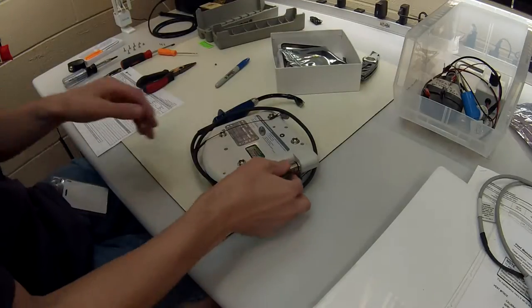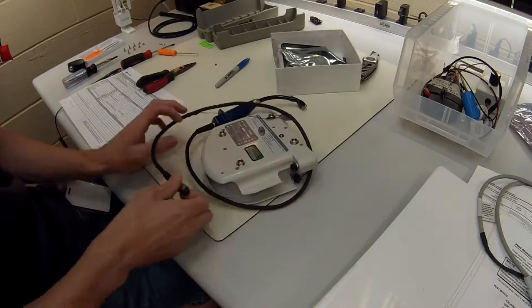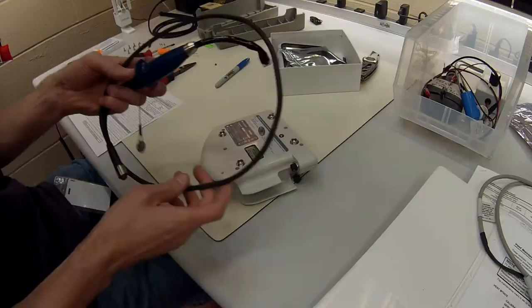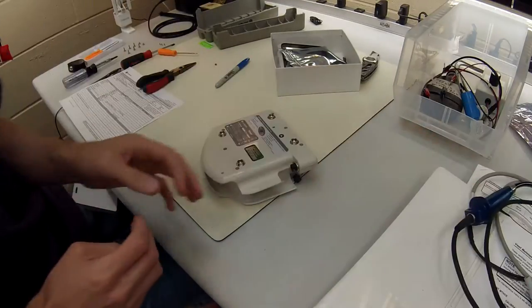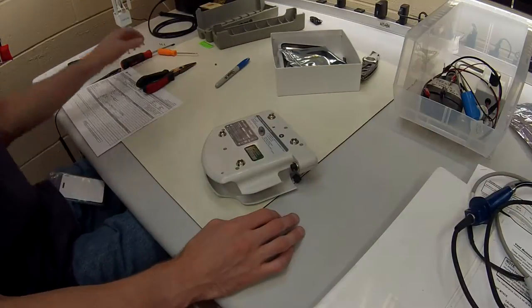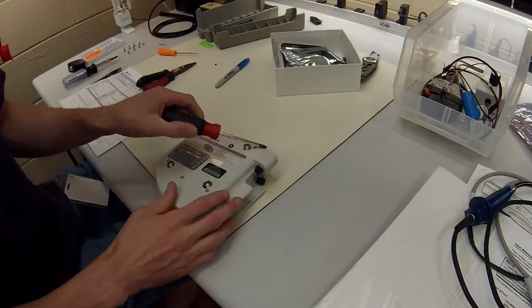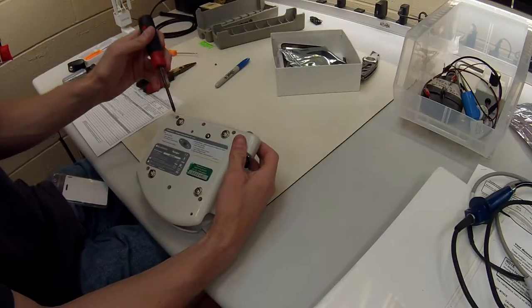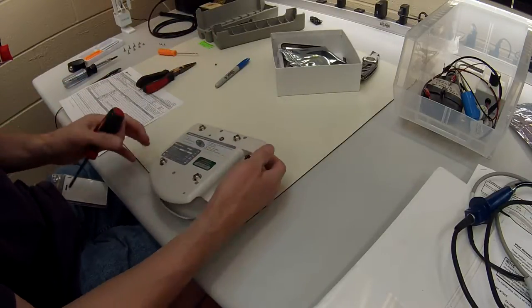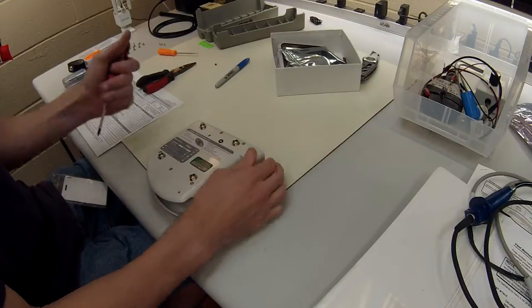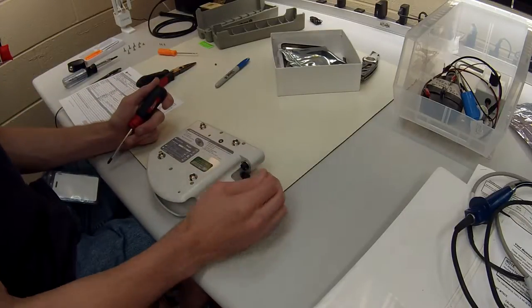Okay, so the first step is we're going to remove the stylet right here. You're just going to twist and pull it out. This can go aside. Next, we're going to remove these six screws right here and the whole back will pop off. So go ahead and do that.